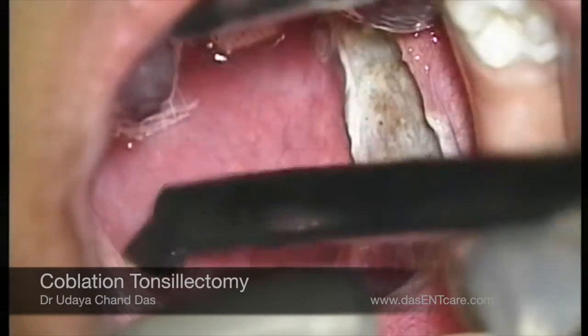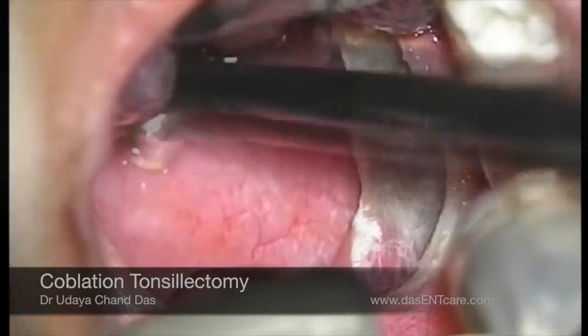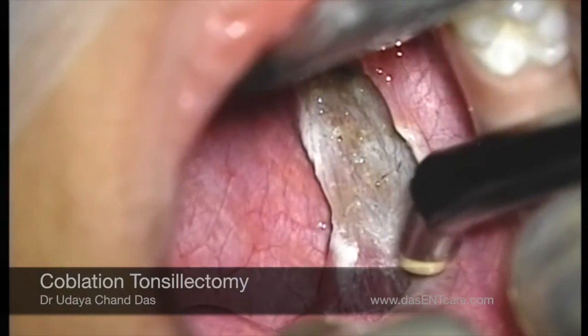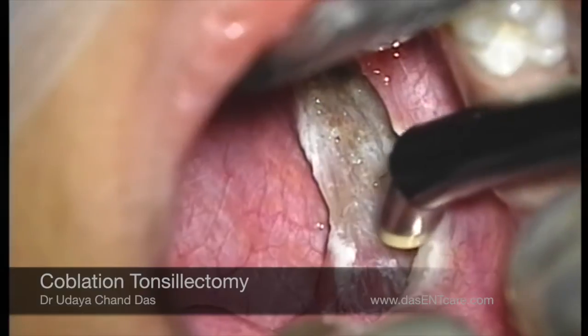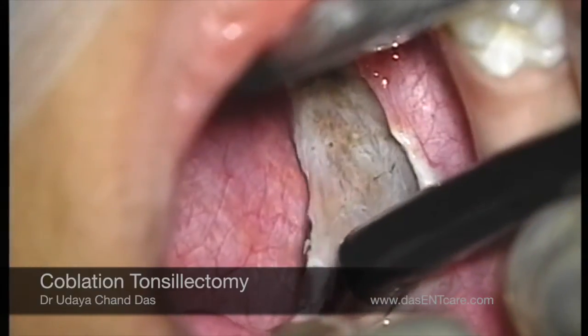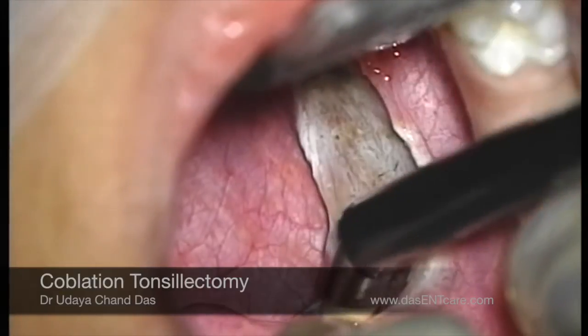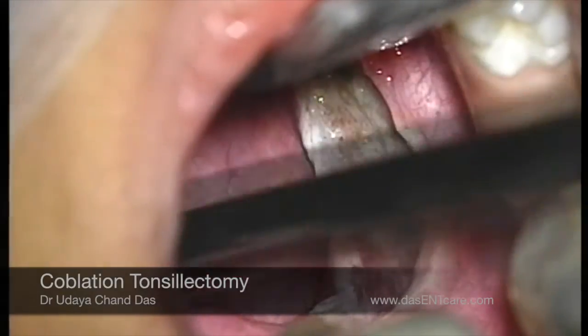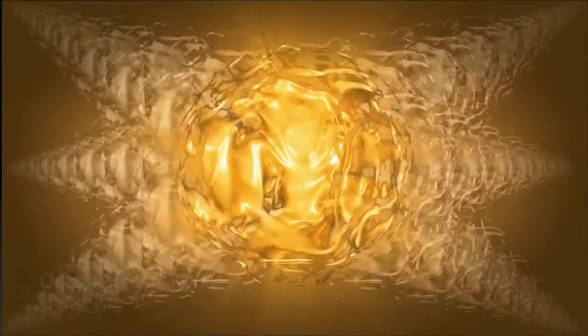That's why the patient will have very little pain in the postoperative period, because the muscles in the tonsillar fossa are not exposed. As you saw, the surgery is entirely bloodless. There are a lot of advantages of this technique — the healing is faster after surgery, pain is absolutely minimum, and blood loss is zero. Thank you.